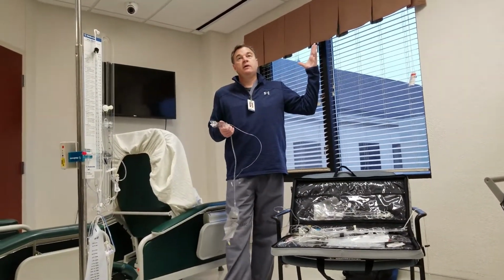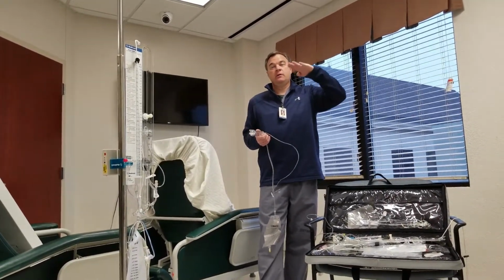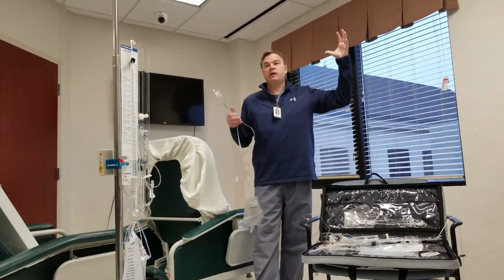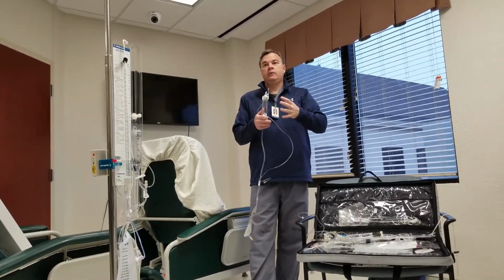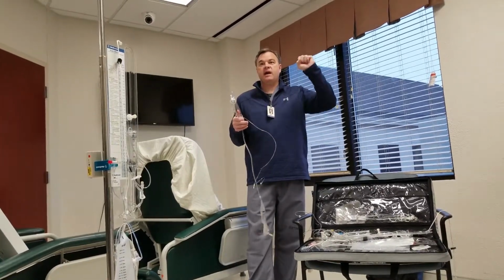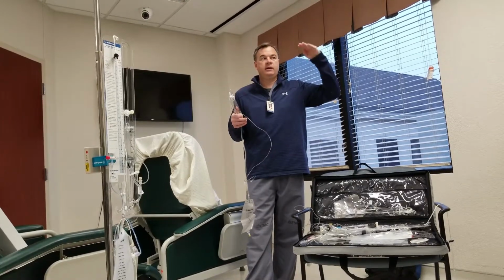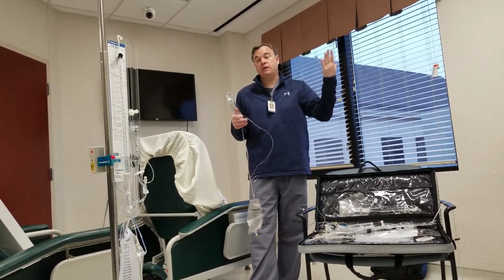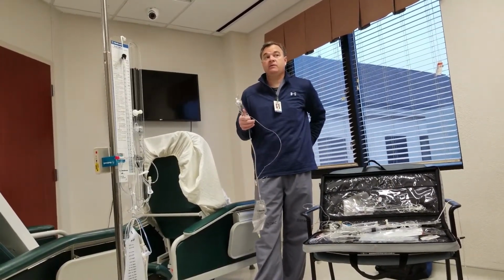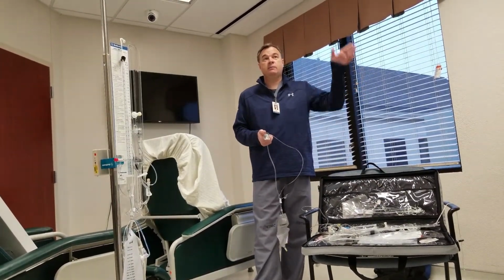Think about any sort of pressure against a patch: you take all the volume out of the balloon, but the balloon's going to fill up again. With a regulator, the balloon stays at a certain level, and people typically do better with pressure if they're going to be managed for 48 hours, because there's not the big peak and valley.